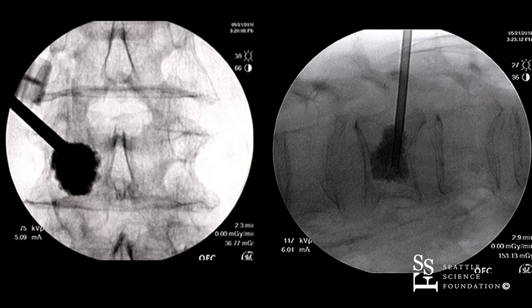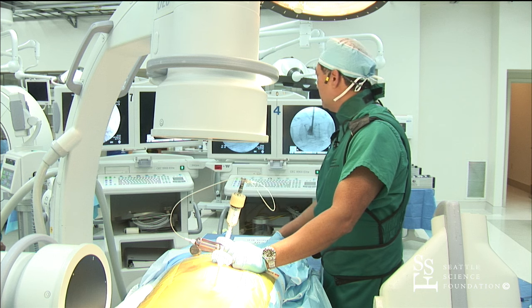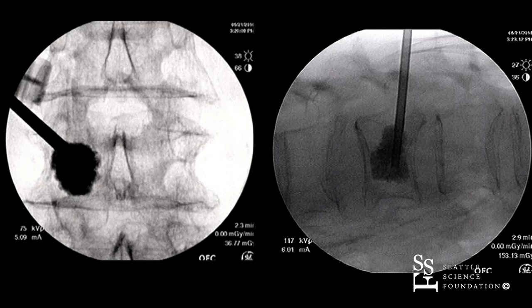We're at three cc's right now. It's staying well-contained within the left portion of the vertebral body, with interdigitation occurring as seen on both the lateral and AP views. There's no extravasation occurring dorsally or anteriorly. Unfortunately, we weren't able to apply the unipedicular approach in this instance, so we'd go to the other side and approach it from the bipedicular — the other pedicle as well.